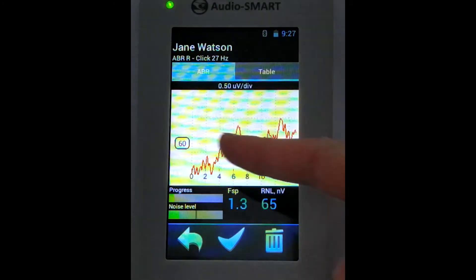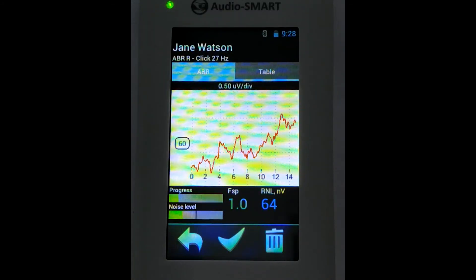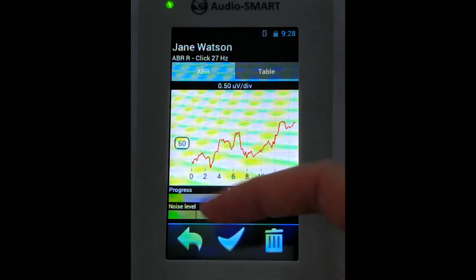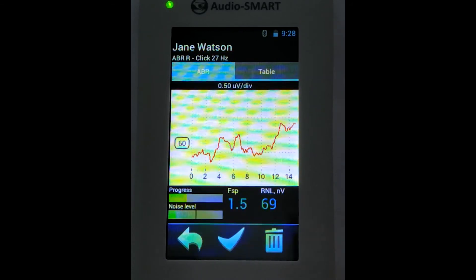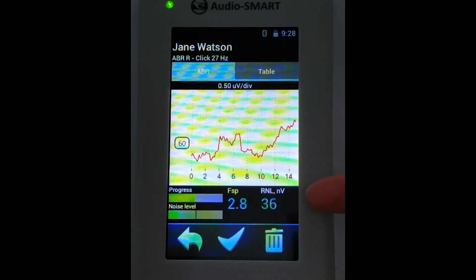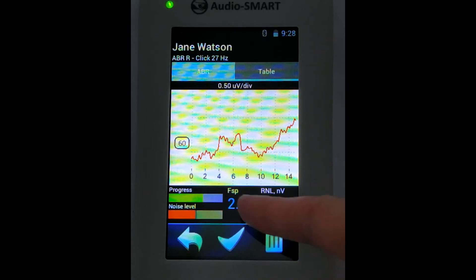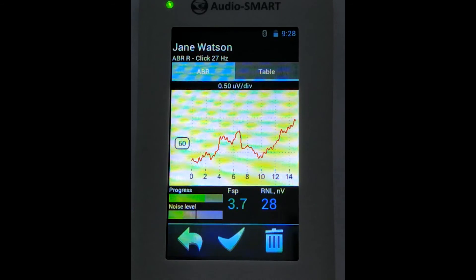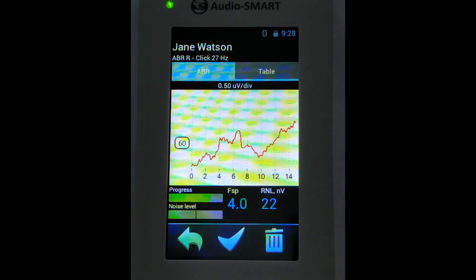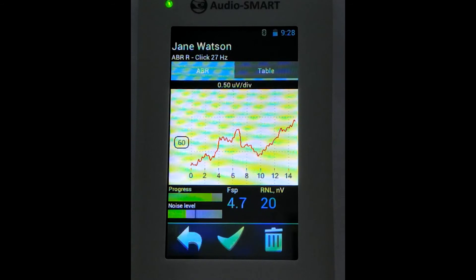We see the morphology of the curve with some peaks, and also graphs showing the progress level out of 2000 stimuli. We also see the noise level graph — you need to see how high the residual noise level is. Ideally it will be not more than 40 nanovolts, as shown here. Here you also see the FSP number — the higher it is, the better, and it should be higher than 3.1.